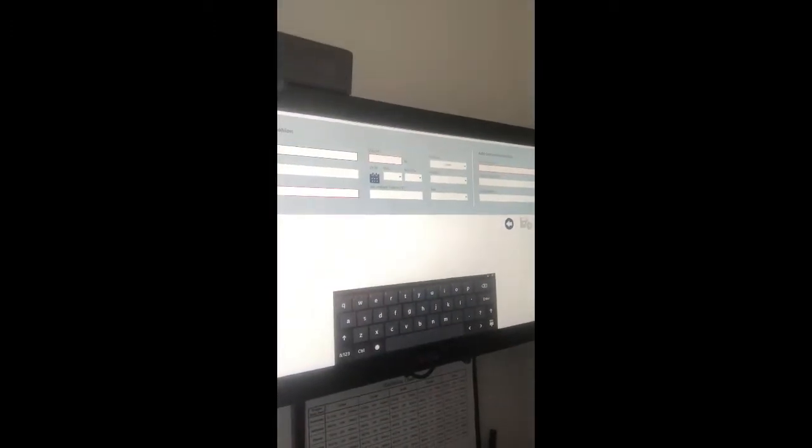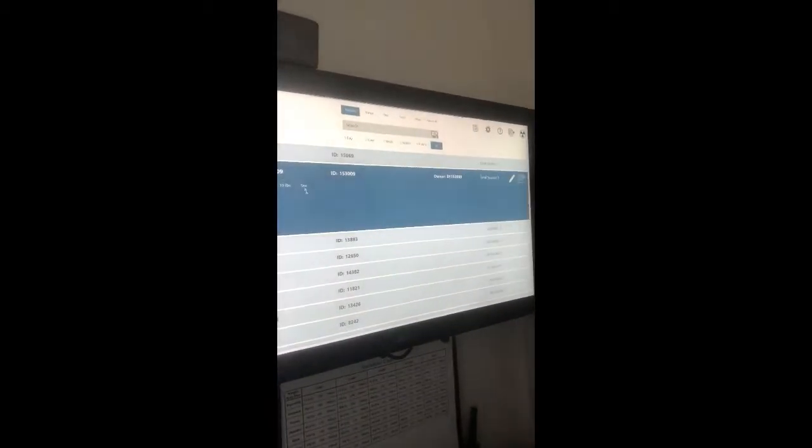And then our computer system that we have here. We don't have our software linked to our x-ray unit, but we can create JPEGs later on and attach them into the file so that they're there, but it's a completely different step. But to go into here to make a new submission for x-rays, you just add here, you're going to add the patient's name and all of their information into this system here, and then what that looks like once that's done, we'll go into one that's already been done.